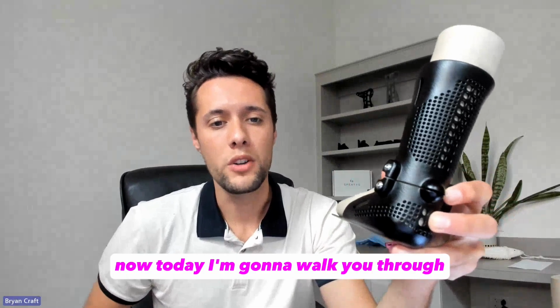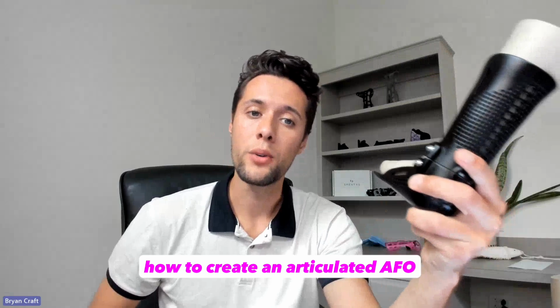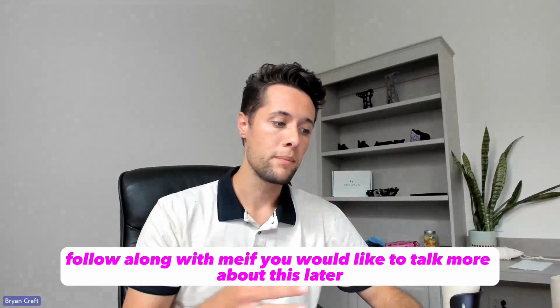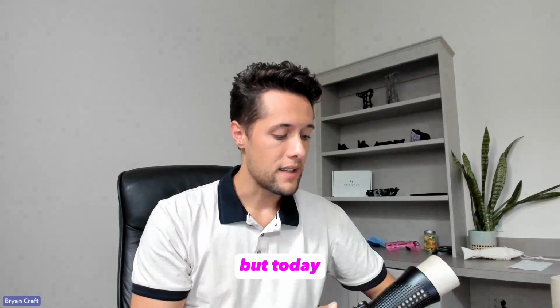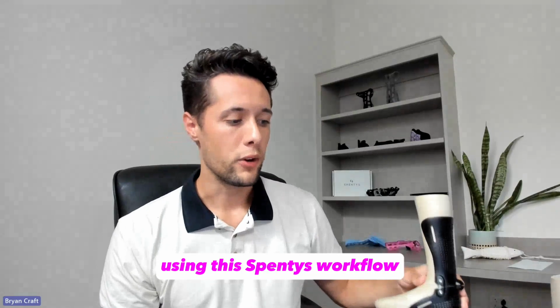Now, today I'm going to walk you through how to create an articulated AFO using the Spentys workflow. If you have our demo account downloaded onto your iPad, follow along with me. If you would like to talk more about this later, be sure to reach out. But today, let's create an articulated AFO using the Spentys workflow.